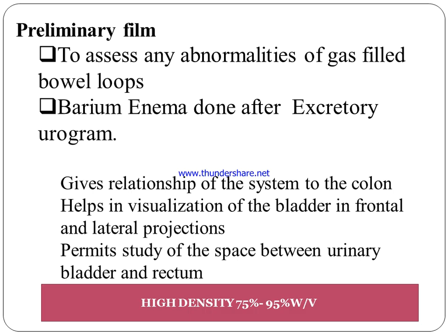In the double contrast technique, a scout film is used. The scout film is taken to assess abnormality of gas-filled bowel loops. Barium enema is done after excretory urogram. It gives the relationship of the urinary system to the colon, which helps in visualization of the bladder in frontal and lateral projection. They also permit study of the space between the urinary bladder and the rectum.